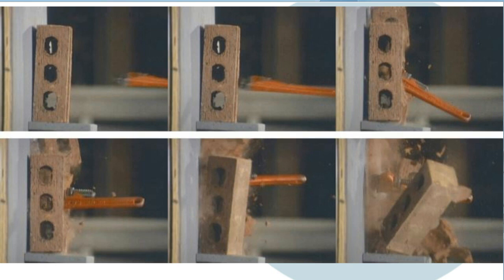And then if we look at the upper left-hand frame, there's an orange blur coming in from the right-hand side. That orange blur, as you see in some of the later frames, is a pipe wrench. So what we are seeing in this series of images is a pipe wrench that is magnetically attracted to the MRI on the left-hand side, and it comes flying in from the right-hand side and strikes a couple of bricks that are set on a little shelf on this piece of plywood. This is illustrating the degree of force that MRI scanners are capable of creating in magnetic or magnetizable materials, in this case a pipe wrench.